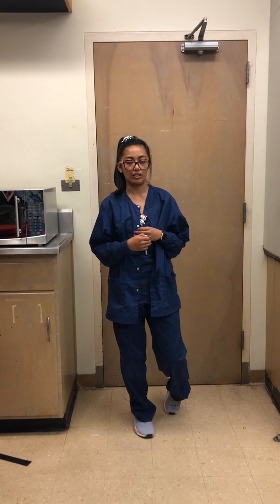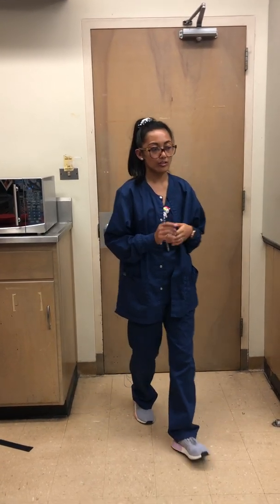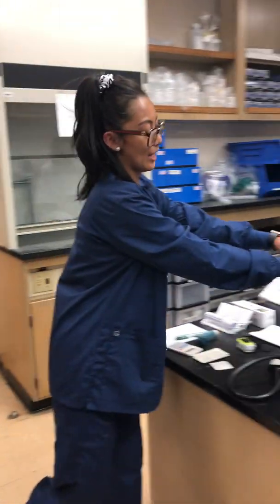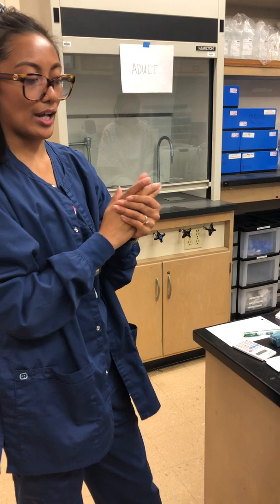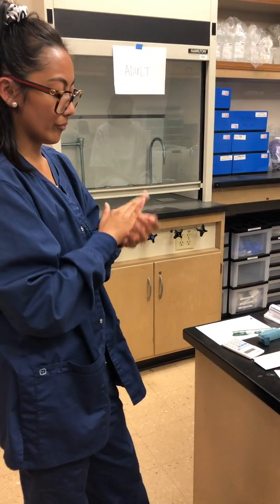So what the physician ordered is an assessment of whether the patient needs an albuterol administered to her. Prior to entering the room, I would also gather my materials, but first I would sanitize my hands with 3 ml of hand sanitizer, rubbing my hands for 15 seconds.